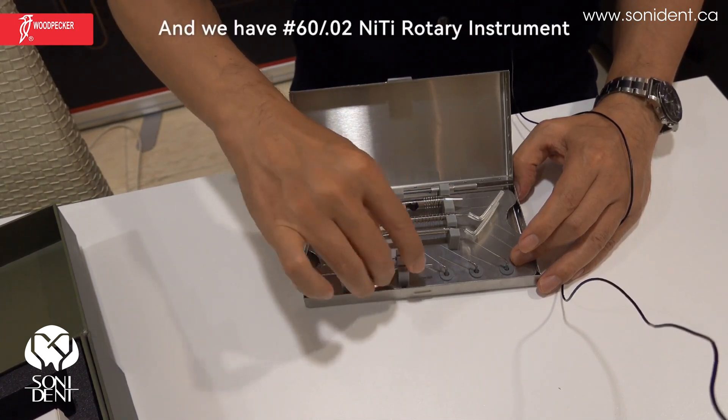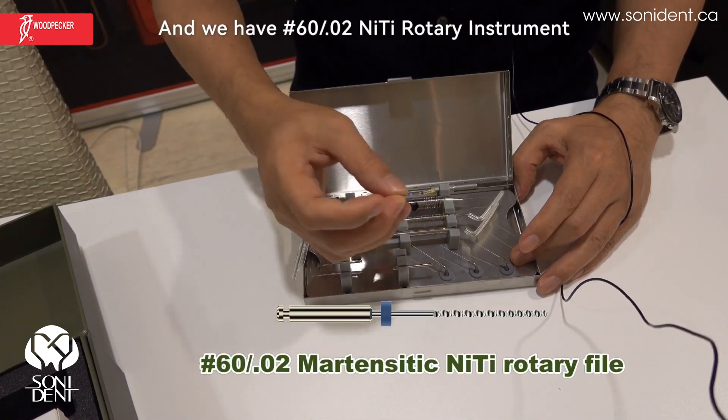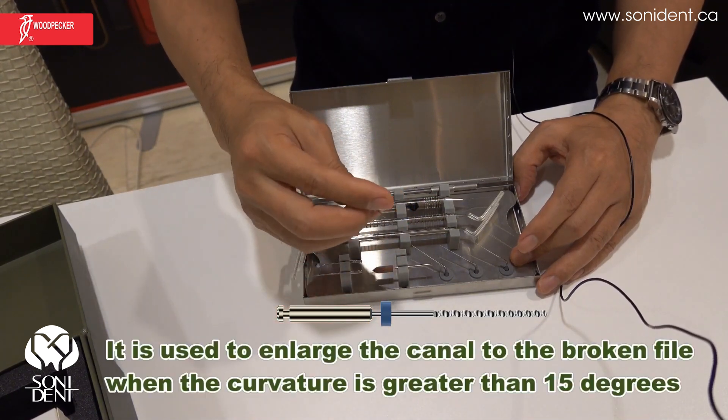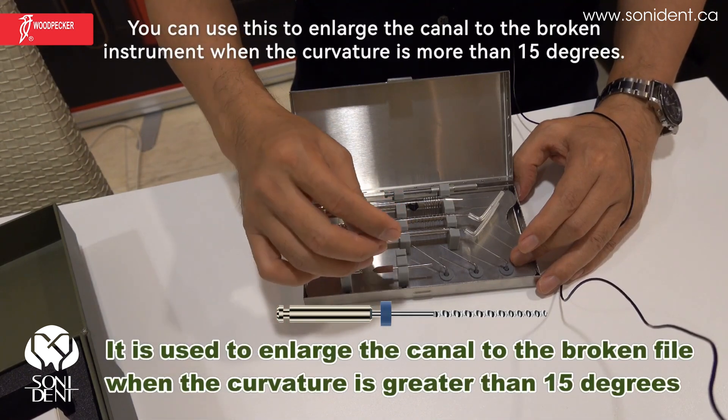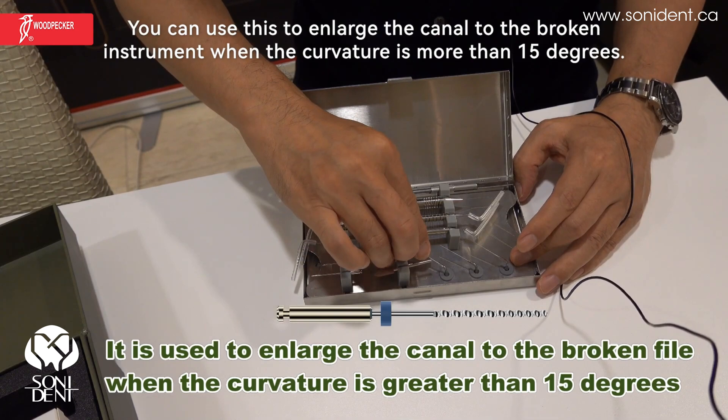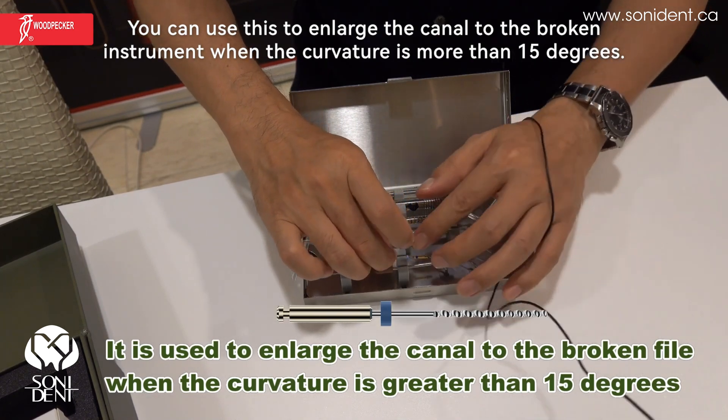And we have the 6002 nickel titanium rotary instrument here. You can use this to enlarge the canal to the broken instrument when the curvature is less than 15 degrees.